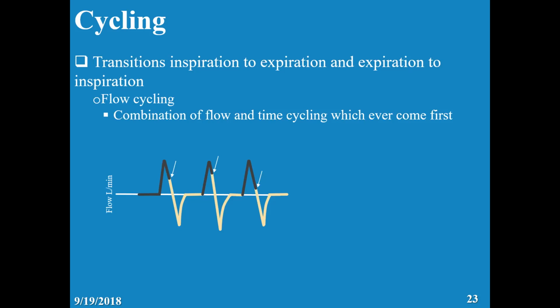Now let's look at the deceleration. Look at this. You can see the machine started and it's 50%. Check again, it's 75%. Check again, it's less than 25%.